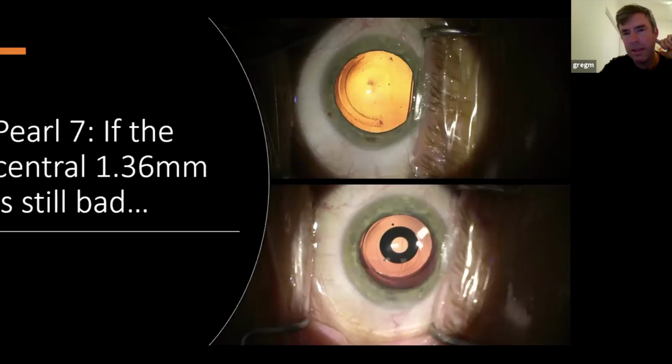And I've asked David to provide us with, so when we do a test, the testing that we do in our clinic for an AccuFocus in our keratoconics is if the spectacle, as you said, John, in your talk, if the patient can refract to a good level of vision with a pair of glasses, in other words, if a symmetrical piece of glass in front of the cornea can give you good vision, then a symmetrical piece of plastic behind the cornea, like a toric lens, might also give you good vision, but more often than not, that's not the case.